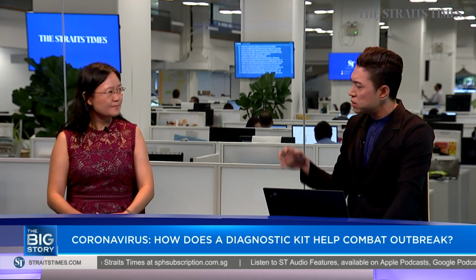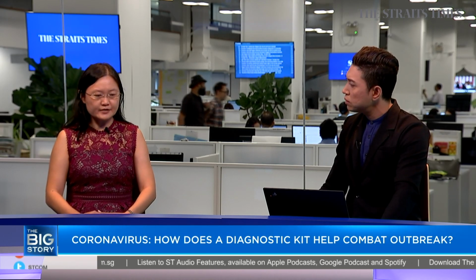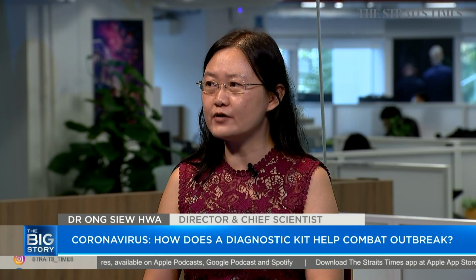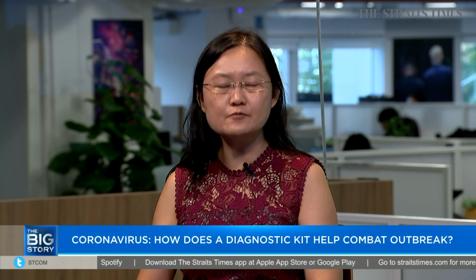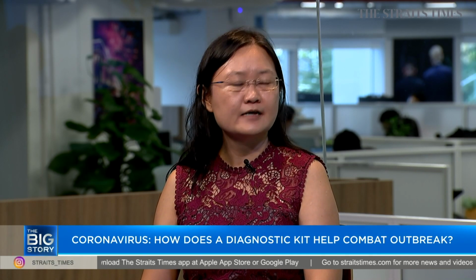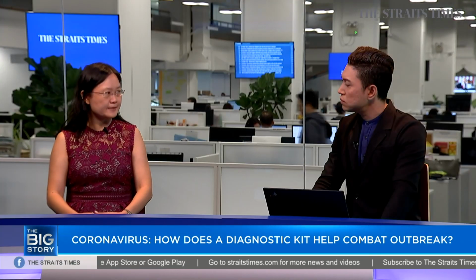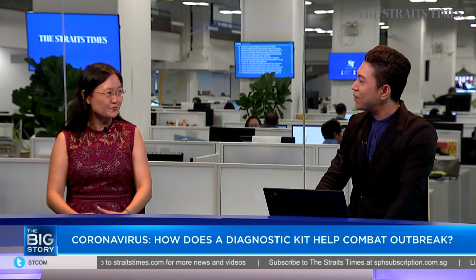And Doctor, if you could tell us as well, now that the kit has been developed, what are the next steps for it? Is it going to be used here in Singapore? Yes, we have a very advanced prototype with the analytical validation done in our lab, and the next step is for us to contact the doctors and work together with them to perform clinical validation. That means actual patient samples will be tested. And to date, for our development, we have used synthetic DNA. Right. And will it be used here in Singapore? Yes, we want to implement it in Singapore as soon as we are able to.